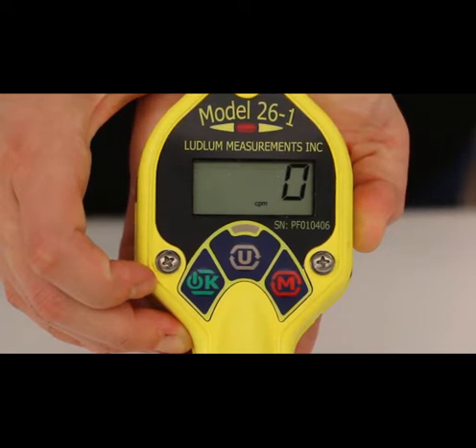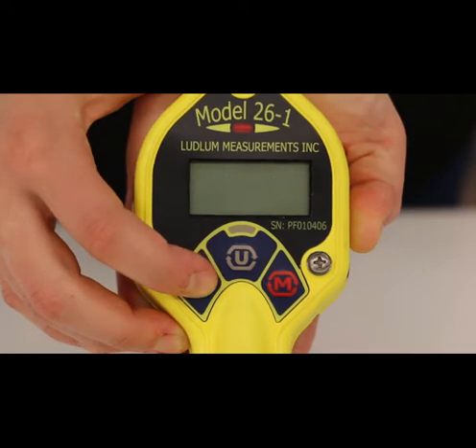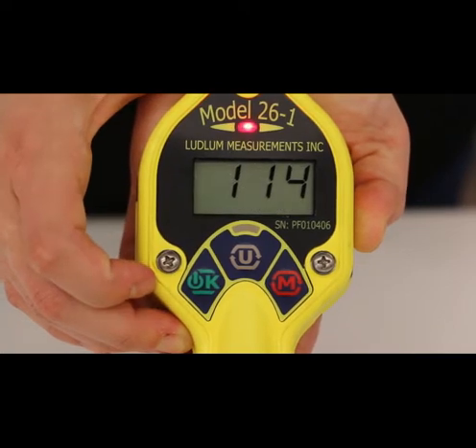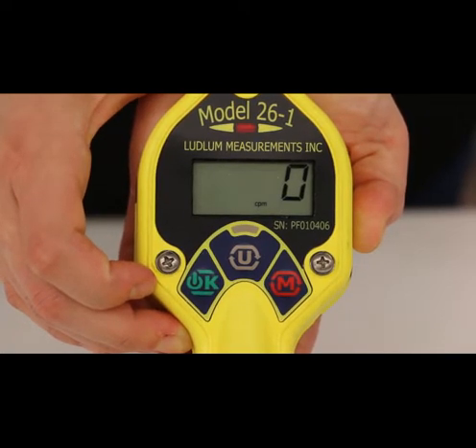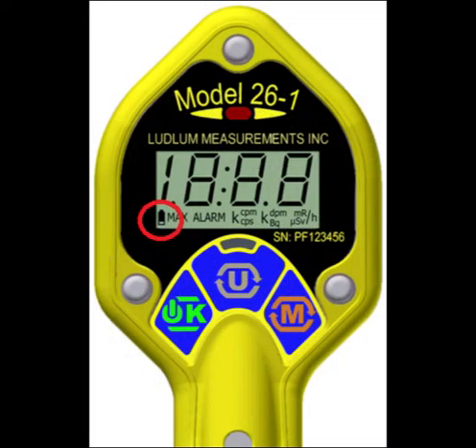The instrument will then move to normal operation, showing the rate meter display. After startup, check to see if the low battery icon is displayed in the lower left-hand corner of the digital display. If it is displayed, the batteries have approximately 16 hours or less remaining and should be replaced.